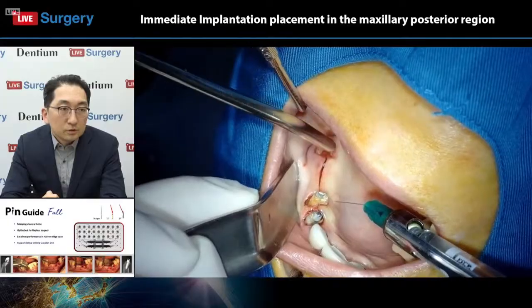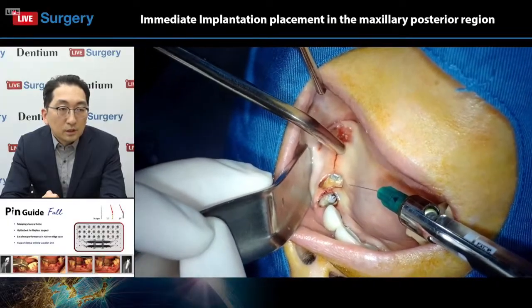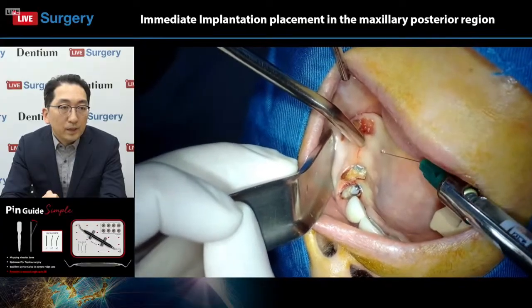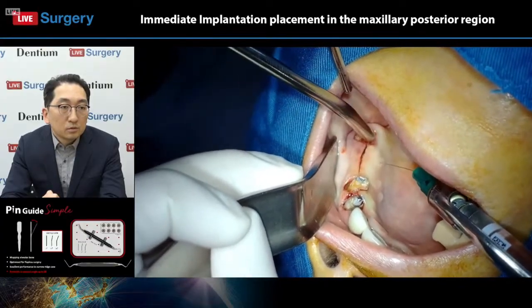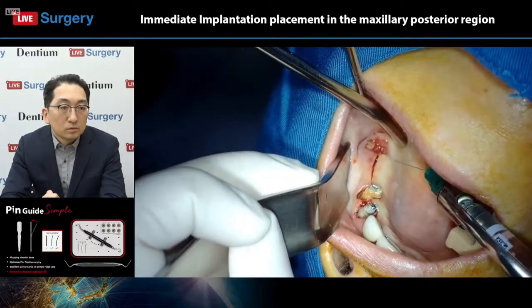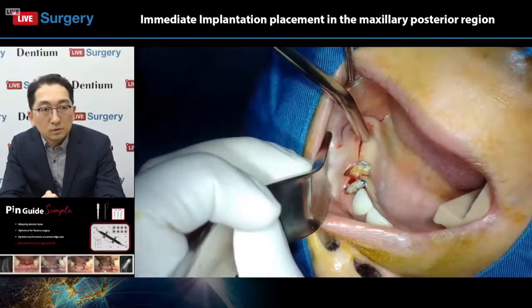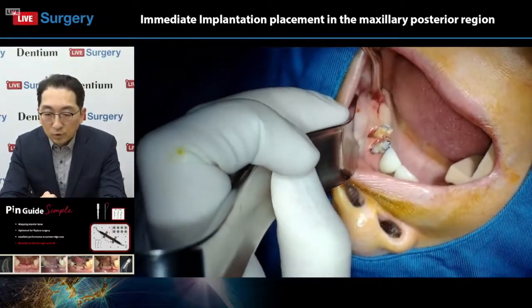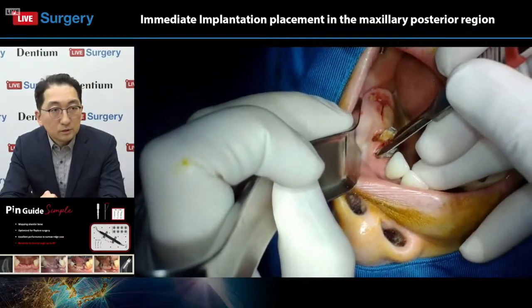During the incision, the patient said she felt the pain, so I give more anesthetic shot.